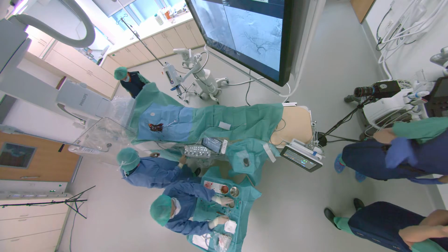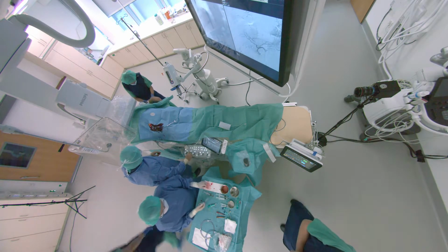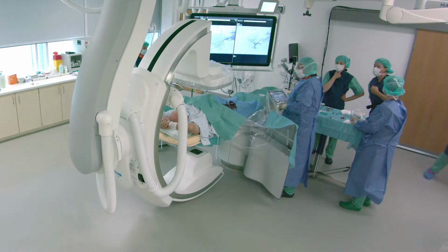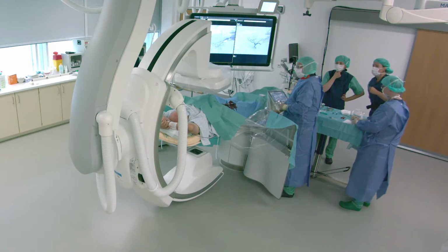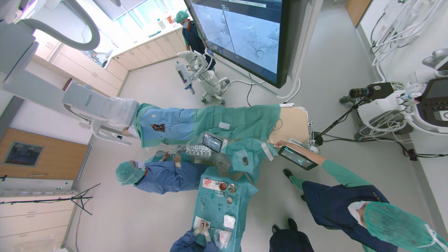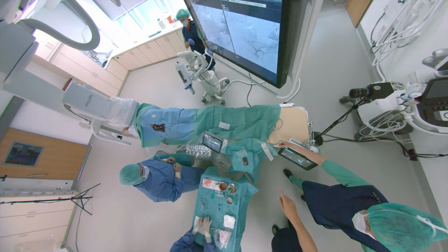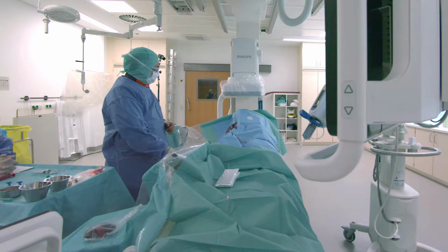To have an optimal result, the patient's arm should be out of the X-ray beam to avoid streak artifacts in the CT volume. Hands under the head will be the best position if this is possible. Also take care that no wires and infusion lines are hanging from the table. Be sure the lead shields are out of the C-arm pathway to prevent collision during setup. The proper injector protocol is set on the power injector.